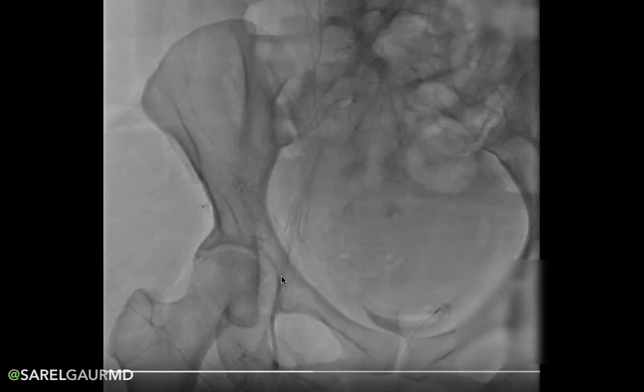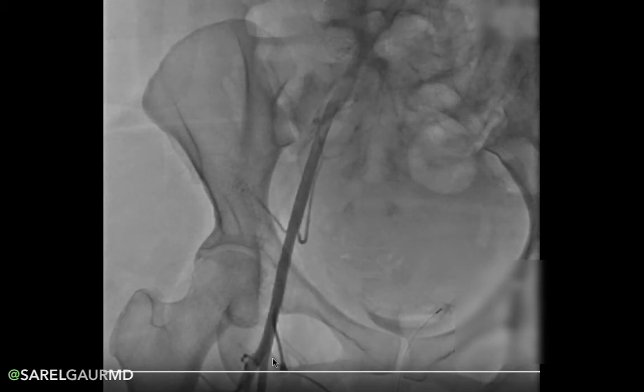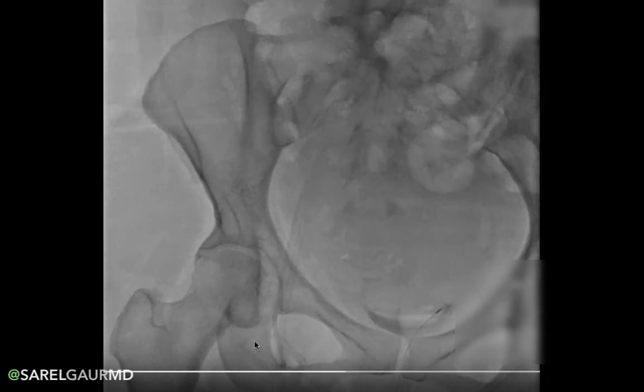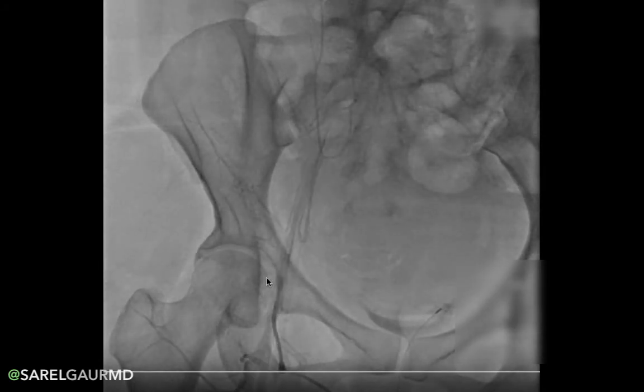As we follow this down, we see the common femoral artery branch into two branches. One we see medially, which is the SFA, or the superficial femoral artery. And coming out laterally, we can see the profunda femoris artery — we know it's the profunda because it has multiple branches in the thigh, including a prominent branch going out to the femoral neck. Between this branch point and underneath the inguinal ligament, we have the common femoral artery. You can see here a 5-French sheath entering this vessel pretty much at the level of the femoral head — a very nice access.